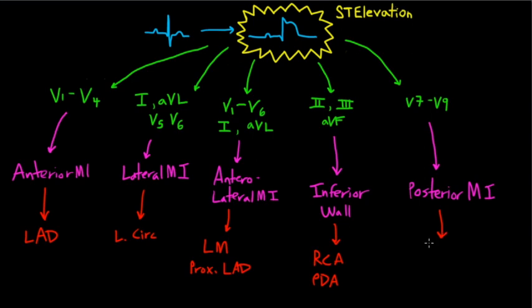Culprit vessel there, probably the PDA, but could also be the RCA as well.